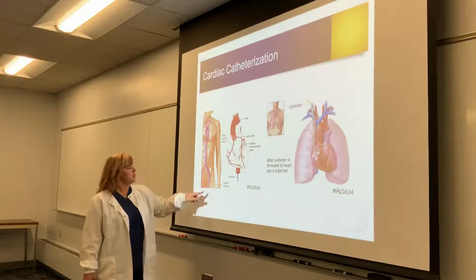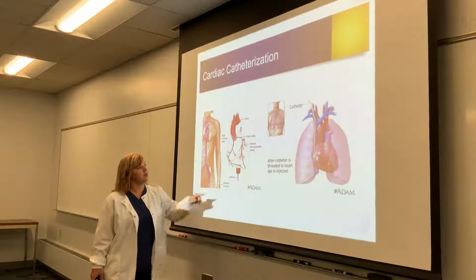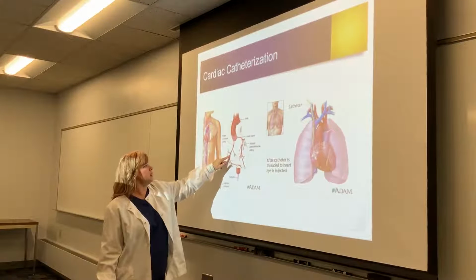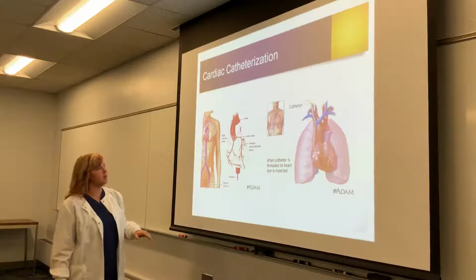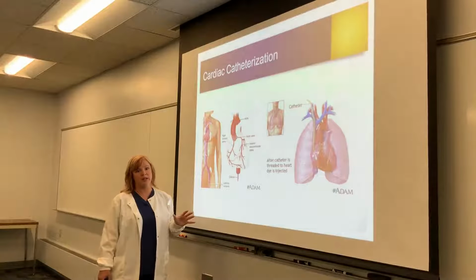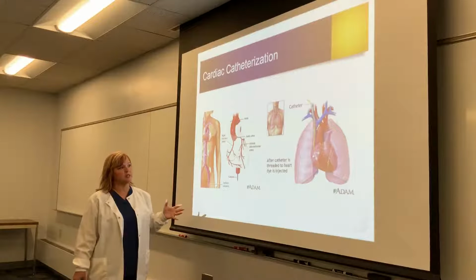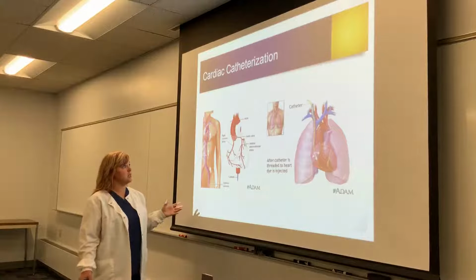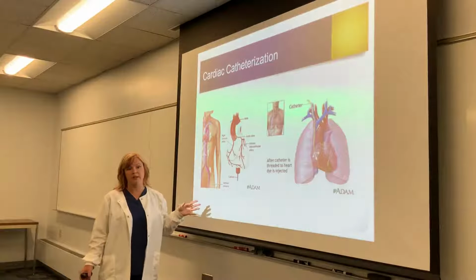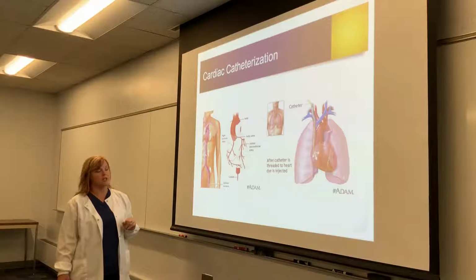Again, just some more images showing you how the catheter goes in through the artery and then is threaded into the heart. It can go into these arteries here and do any intervention. And like I said, it can be diagnostic as well, because they might just be going in and getting pressures, ejection fraction. They might be looking to see if there are any areas that are plaqued that need intervention. Maybe the intervention that they need is too severe for this particular problem. They can look at the functioning of the heart valves.